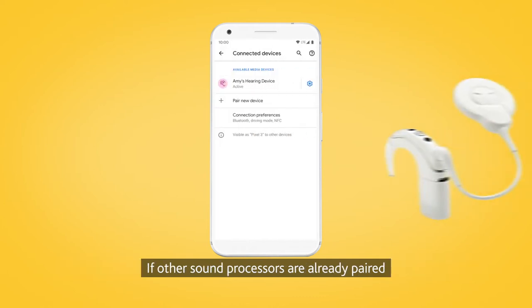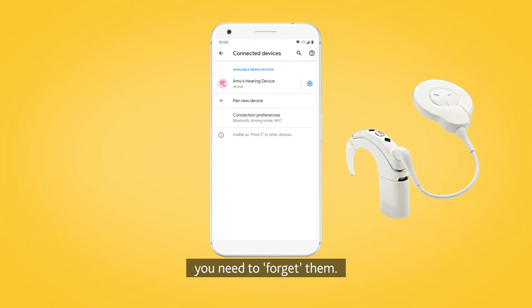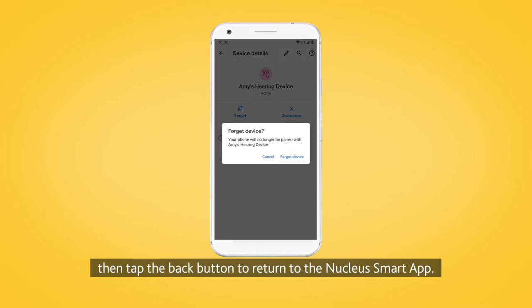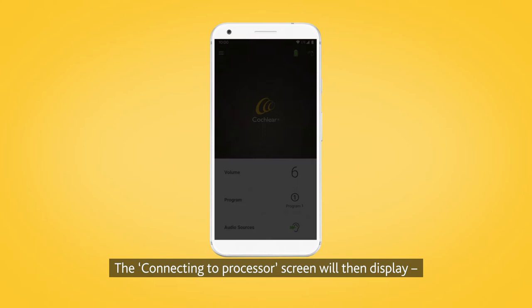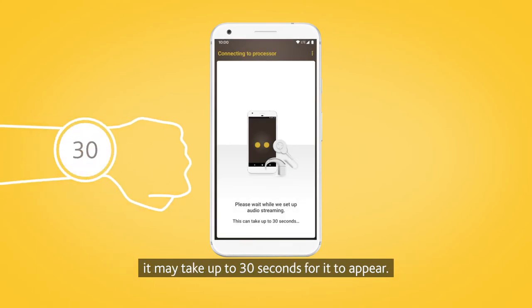If other sound processors are already paired or streaming to your smartphone, you need to forget them. To do this, follow the screen prompts to forget the processors, then tap the back button to return to the Nucleus Smart App. The connecting to processor screen will then display. It may take up to 30 seconds for it to appear.